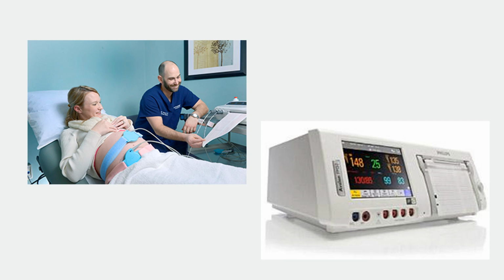Below the fetal heart rate on the left is the blood pressure. It also detects the pulse, and you can get the mom's pulse ox. So as you can see, these monitors do a lot. To the very far right, you can see some paper coming out. Now this paper is part of the medical record. We used to just have that to keep as part of the proof of the baby's heart rate, but now a lot of the information is archived in the computer. But these still can print out the strip.